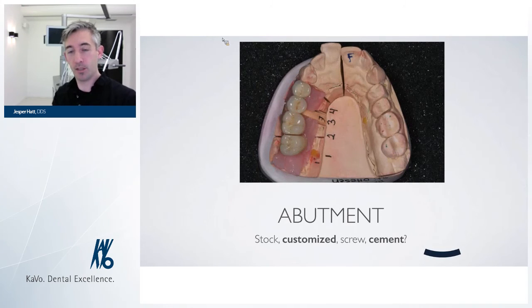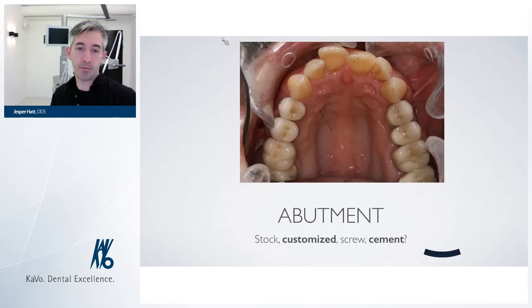Cost is a little bit of a compromise here, but it's working. The space between the molars is because the soft tissue on the model displaces the most posterior crown a little bit. And as you can see, the final case here in the mouth of the patient.